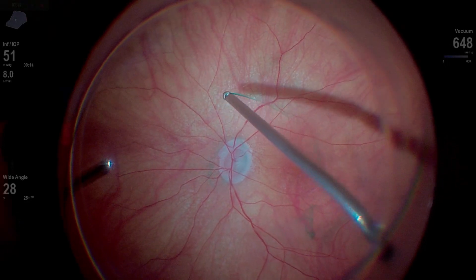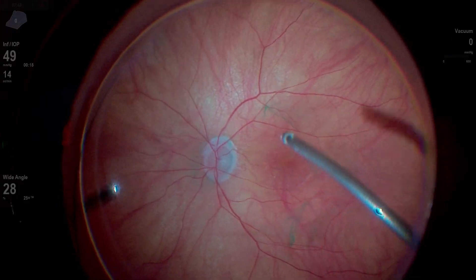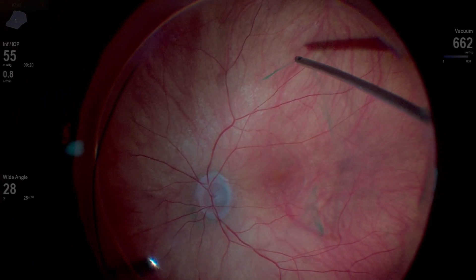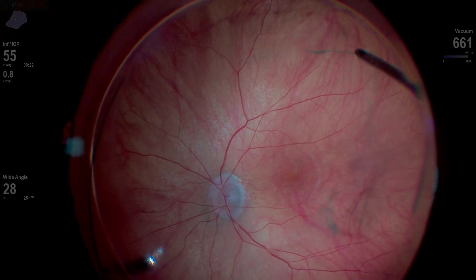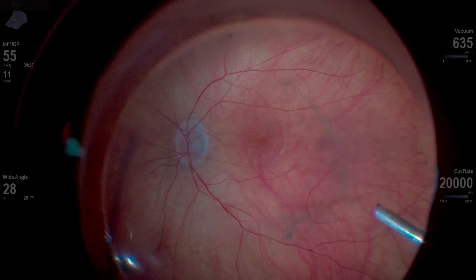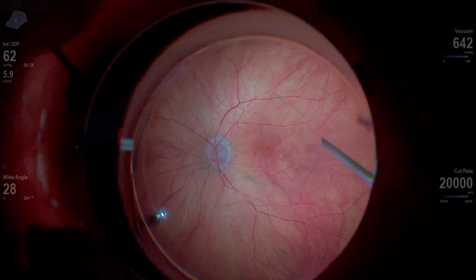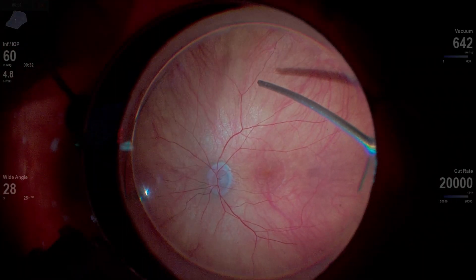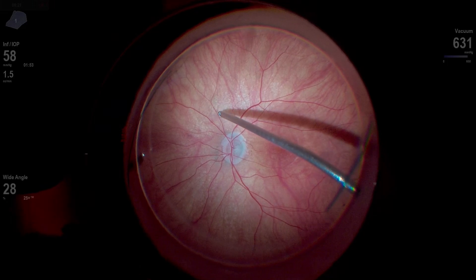In cases like this, I'll try to get the vitreous out as far as I safely can. If I start to see hemorrhages developing in the retina or traction on the retina, I'll stop. In this case, I got it up to about the equator temporally and just a little posterior to the equator nasally. Sometimes doing a vitrectomy actually allows fluid to dissect that vitreous up — in this case it didn't help much.